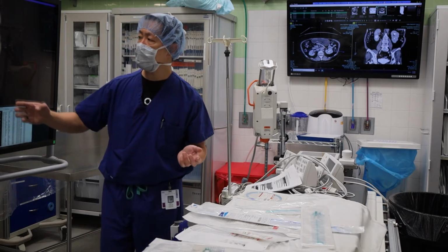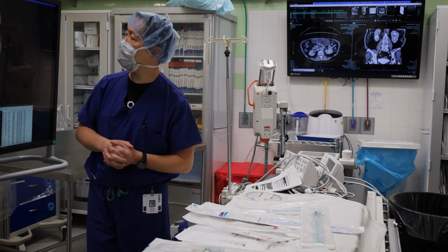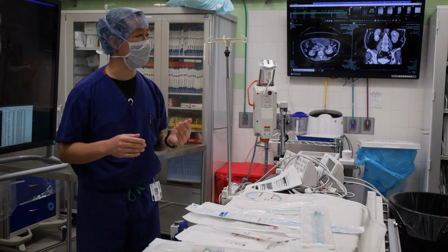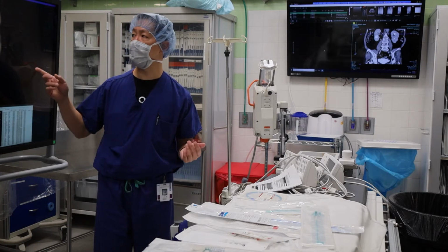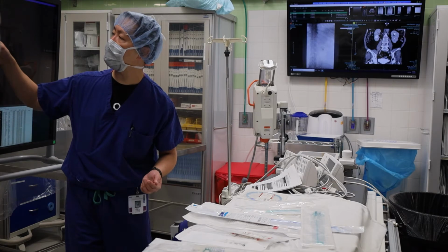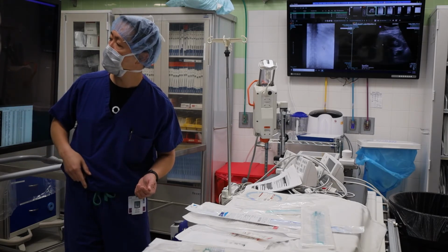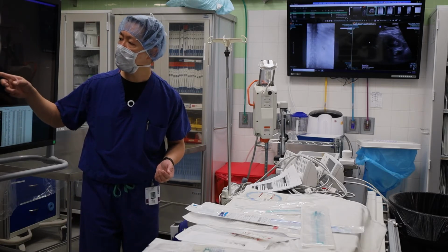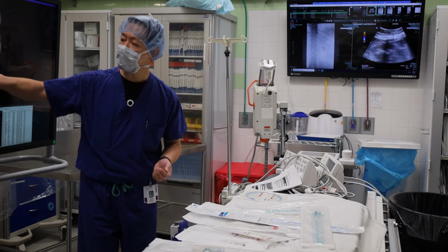This is a case that we did of somebody who has an obstructive stone. Okay, so can you show the perc neph pictures, please? So this is a pre-PCNL access, and the goal of this, similar to perc neph, is so that the urologist can then follow our line and go in. And you can actually see on the, go to the first picture, yeah, perfect. And then can you also pull up the ultrasound? Thank you. Okay. Kidney, and then scroll on the ultrasound. Yeah, okay, good. This is the stone.